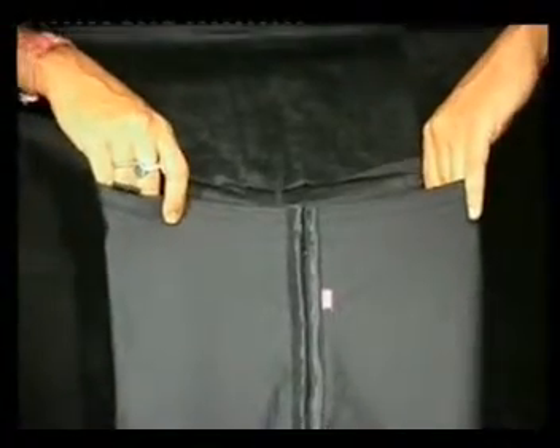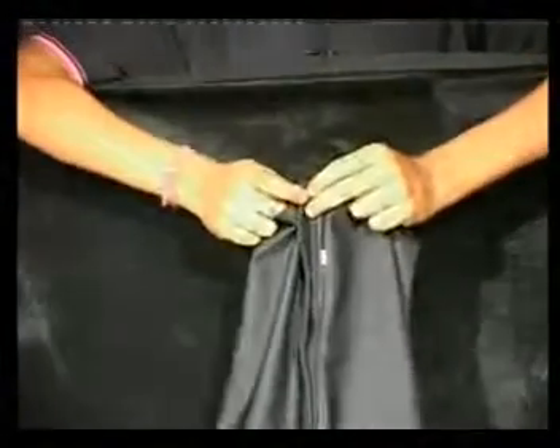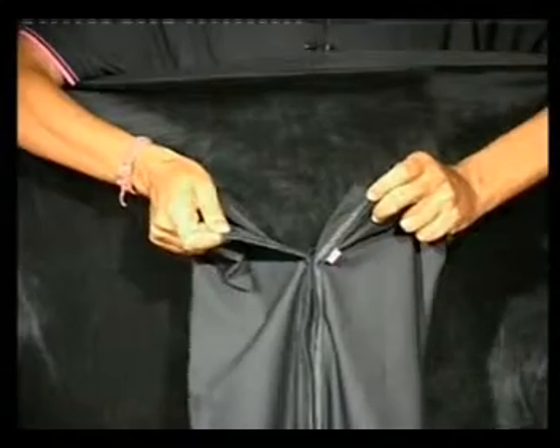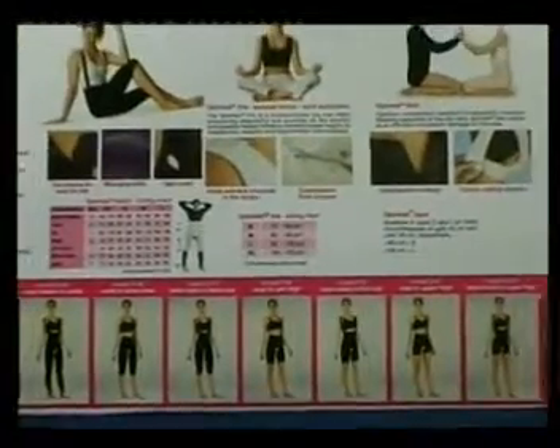Lipomed Basic is available specially in black colour, as patients wear it under their garments. It provides good compression and its hook-and-eye closure holds it properly, especially after liposuction. Lipomed Basic is available in different models.